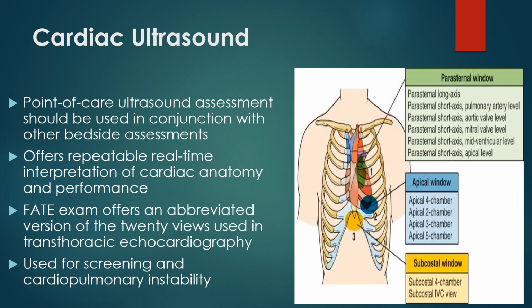It should be used as well in conjunction with other bedside assessments, and these include your own intuitive thought, empiric judgments, some of the things that you just know. For instance, you just know you need volume, but you just have given a bunch of volume, so it's used in conjunction with what your knowledge is of what you should be treating the patient with. It also offers repeatable real-time interpretation of cardiac anatomy and performance.